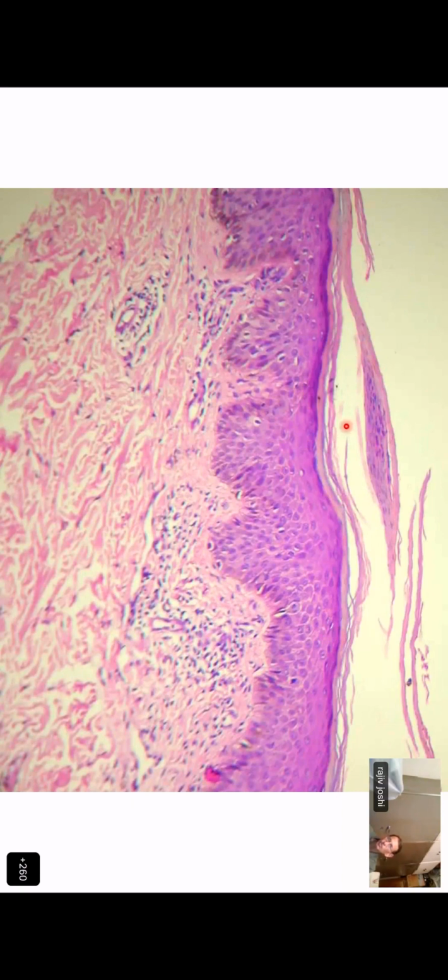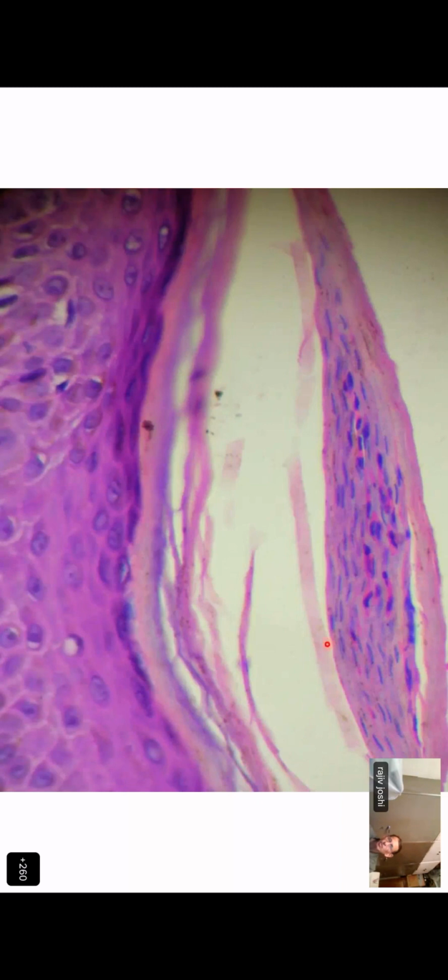But in the stratum corneum, you have a single conical mound of parakeratosis with neutrophils. This is very typical for psoriasis. So this is guttate psoriasis. The disease happens so rapidly that it doesn't give time for the psoriasiform hyperplasia to develop. And because it is rapidly happening, the granular layer too is well preserved.